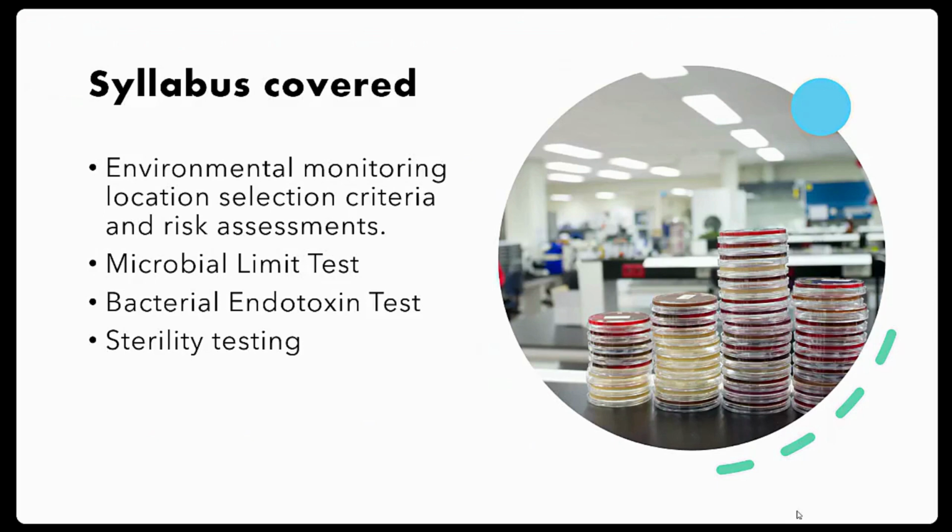Next, what is the bacterial endotoxin test? By this test, we can come to know how much endotoxin content is present in the sample. This is also for water samples, API samples, and finished samples.